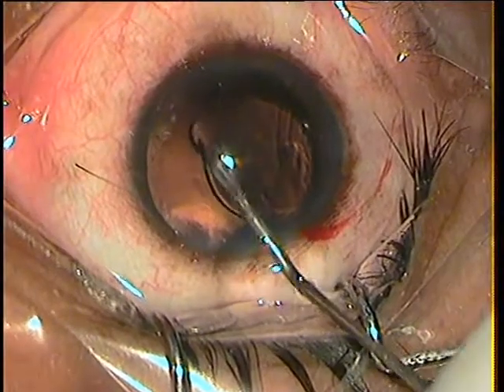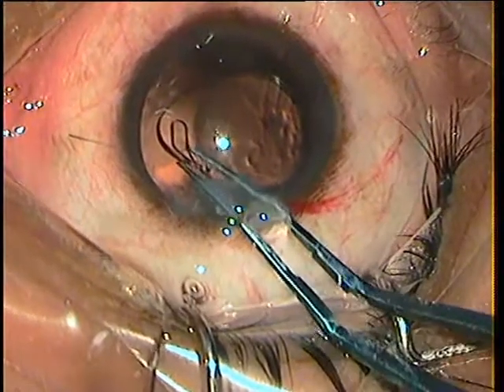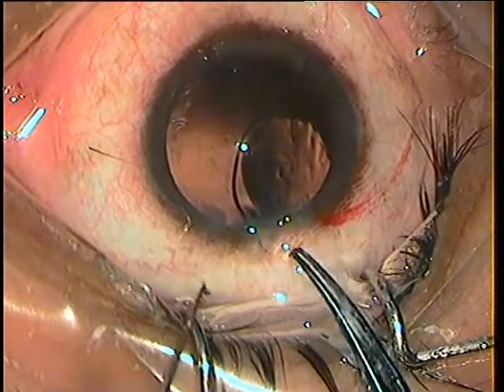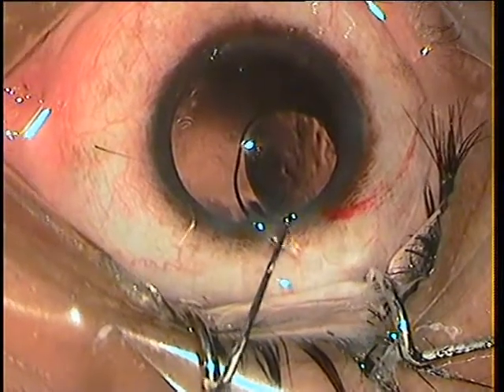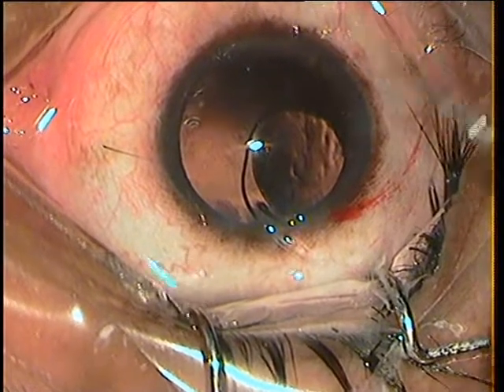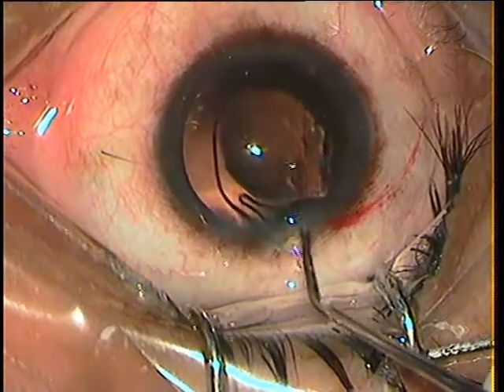This is a single-piece hydrophobic pre-loaded lens. I am using Utrata's forceps — I should be using McPherson's but the tips were not good, so I used the Utrata's for this. I have pulled out the intact haptic to the wound.